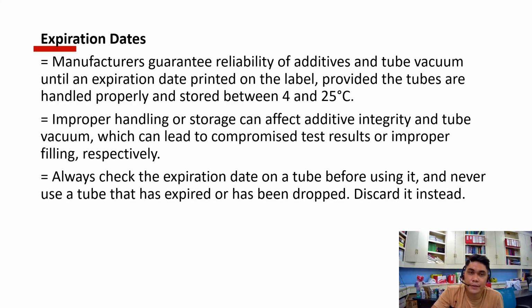Then next, you have the expiration date. Manufacturers guarantee reliability of additives and tube vacuum until an expiration date printed on the label, provided the tubes are handled properly and stored between 4 and 25 degrees Celsius. Improper handling or storage can affect additive integrity and tube vacuum.